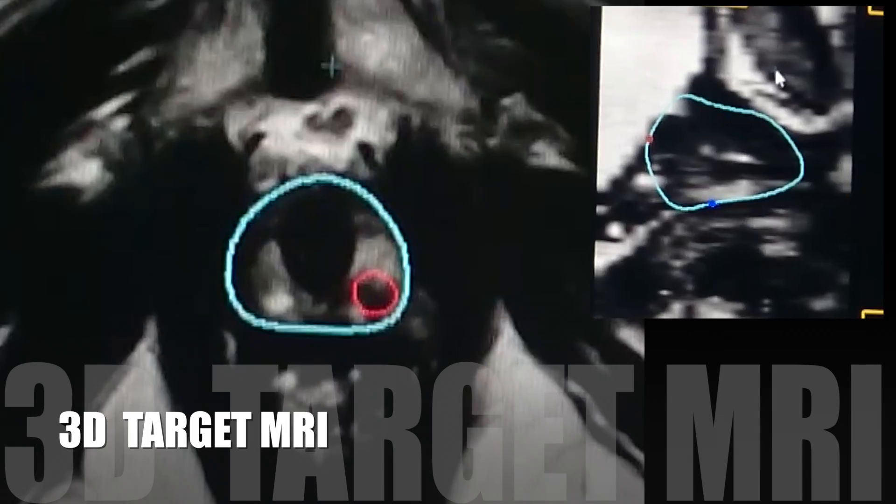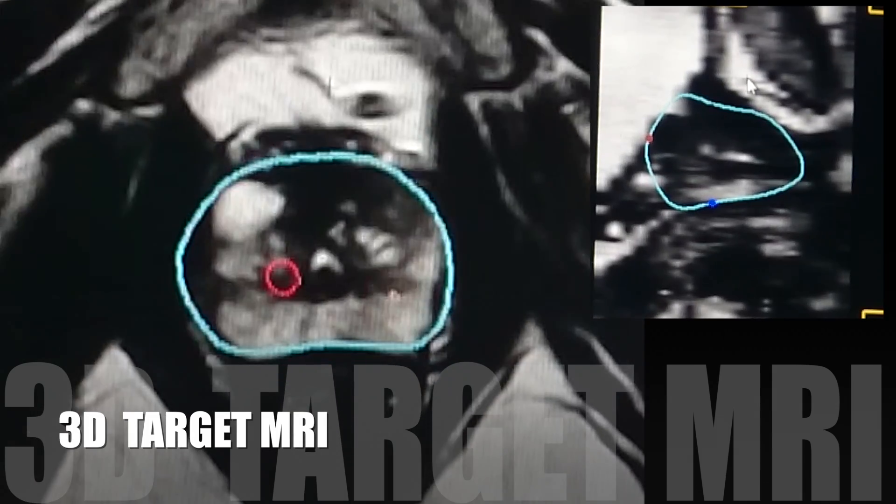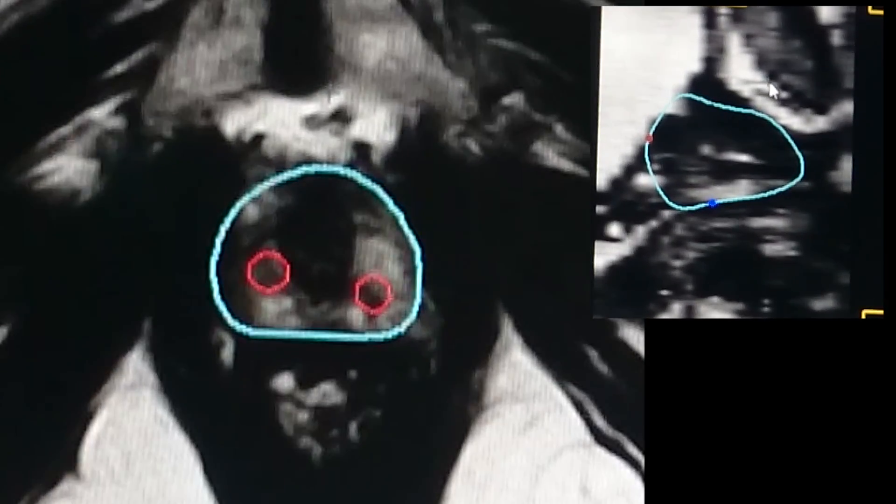Different targets can be delineated on MRI and appear on the ultrasound images with millimeter precision.